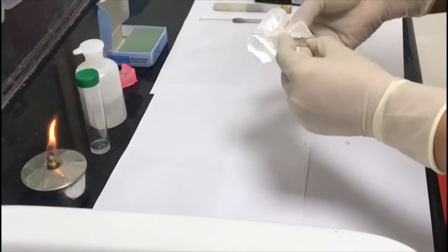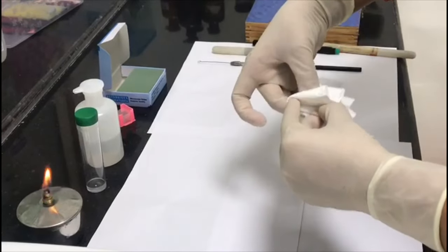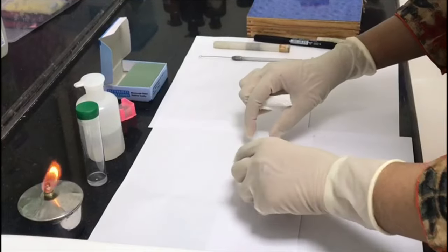Now we are going to demonstrate how to make a KOH mount. First step is to take a glass slide and clean it using a blotting paper.